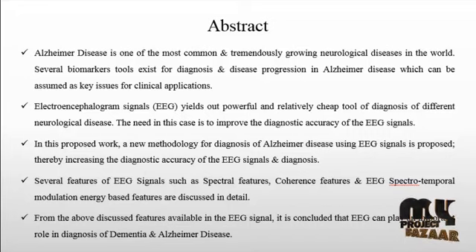As recorded from multiple electrodes placed on the scalp, EEG is most often used to diagnose epilepsy, which causes abnormalities in the EEG readings, and it is also used to diagnose sleep disorders, coma, encephalopathy, and brain death. EEG used to be a first-line method of diagnosis for tumors, strokes, and other focal brain disorders, but this use has decreased with the advent of high-resolution anatomical imaging techniques such as magnetic resonance imaging, that is MRI, and computed tomography, CT.